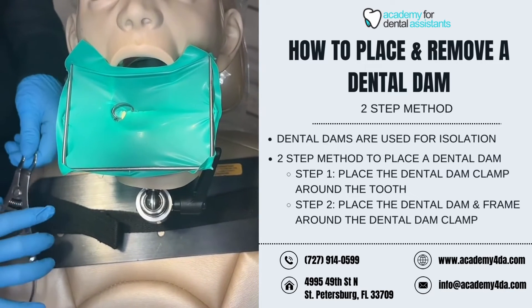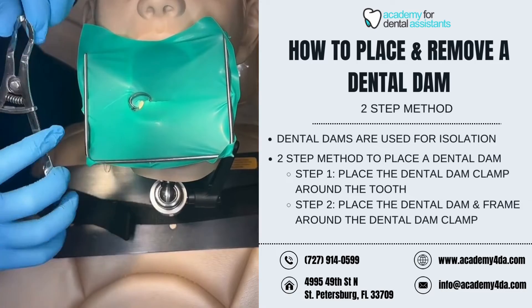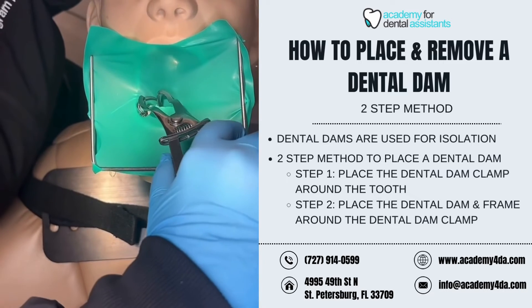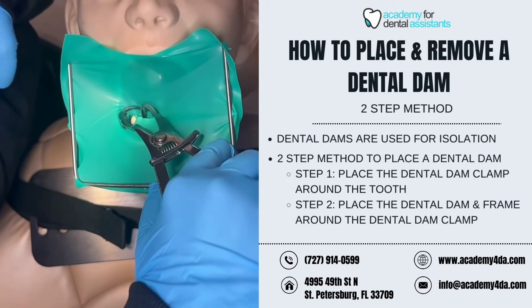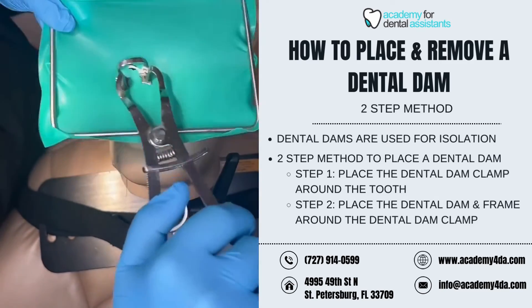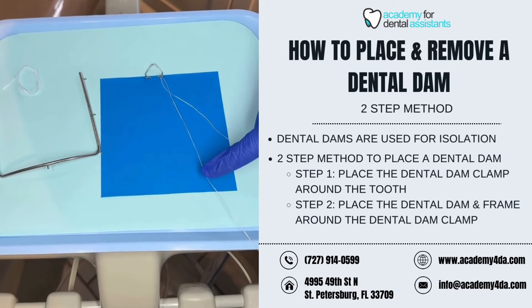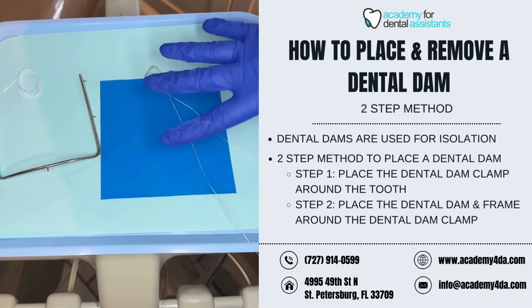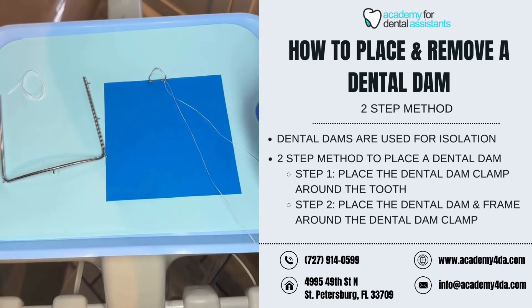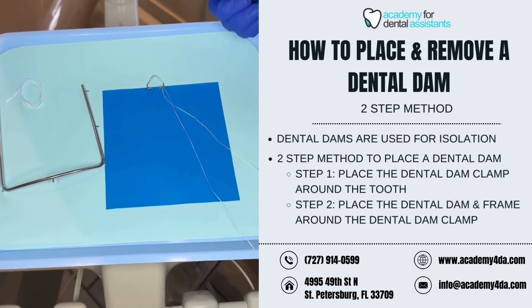To remove the dental dam — same as the one-step method — I'm going to grab my dental dam forceps and line up the beaks or prongs with the holes inside the dental dam clamp, squeeze to widen it, and it will come out in one piece. Once removed from the patient's mouth, you want to inspect the dental dam to make sure it's still intact. If you notice any voids in the material, use a piece of floss to floss the mesial and distal contacts of the tooth or teeth that were worked on to make sure they're clean.